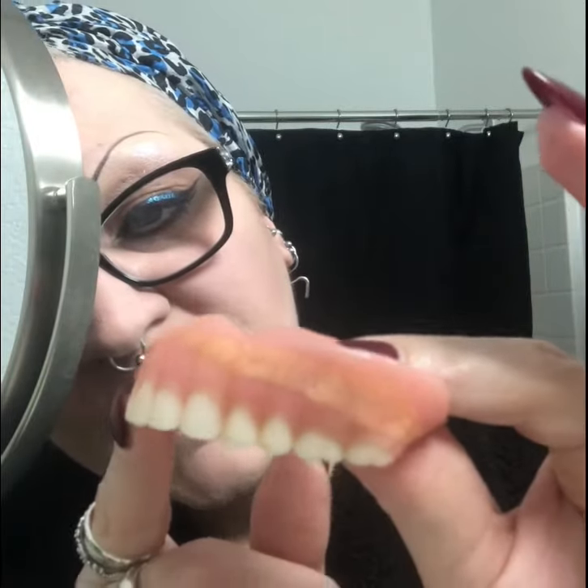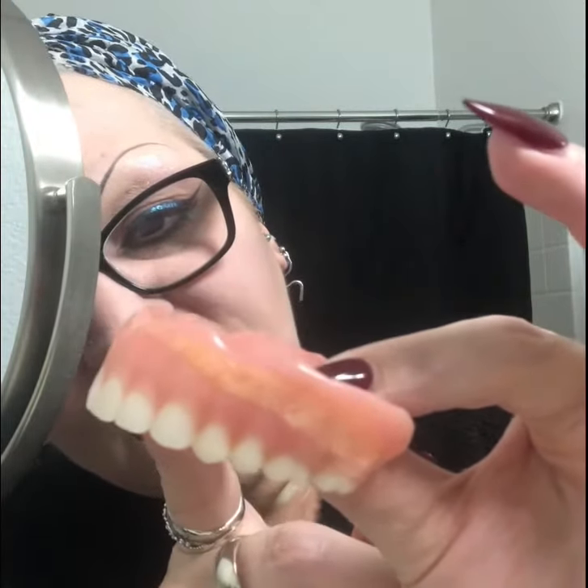These ones fit really, really good. As you can see, that's a better vantage point — you can see all the changes they have made, and now they finally fit after having my gums shrink for two years.